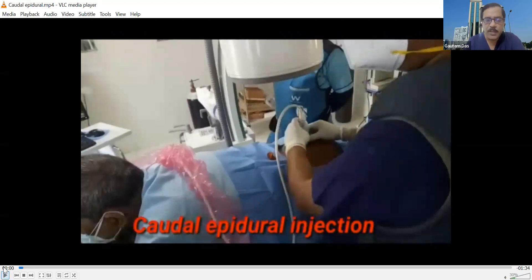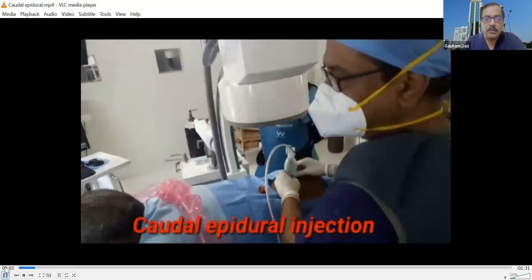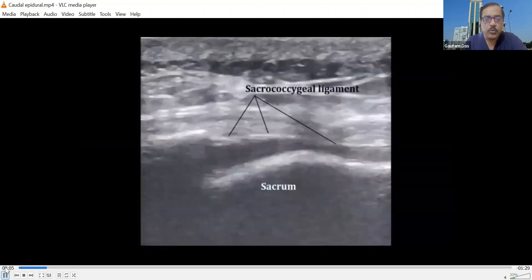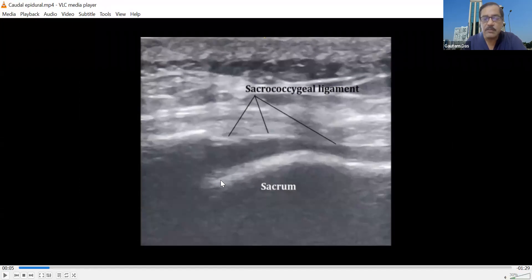For caudal epidural steroid injection, patients should be lying prone with the legs internally rotated and the ultrasound probe is held in the midline in long axis. We are going to get this picture. Here, this is the sacral crest in the midline, then the sacrococcygeal ligament, and this is the sacral plate.